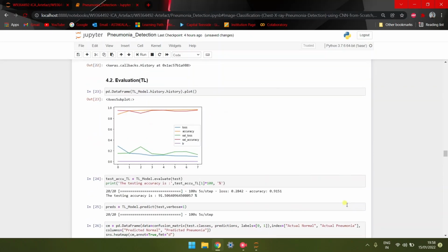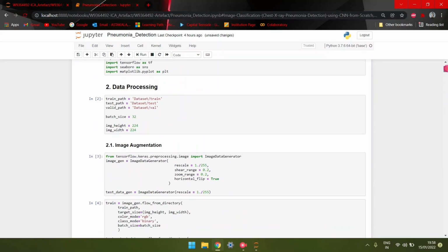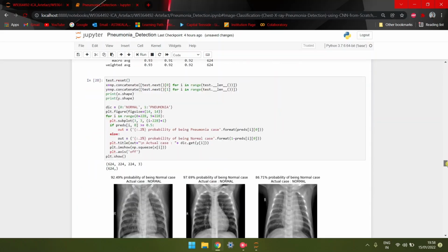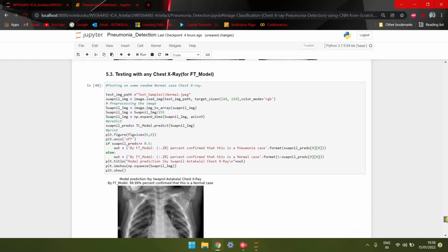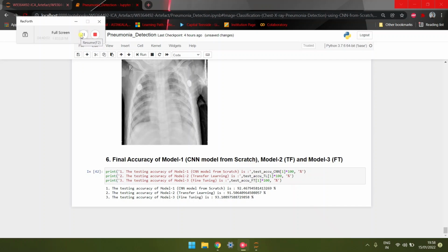So this is a short brief about the project. It took me about 4.5 hours to run the complete project. So the video might be fast, to cover all the things.